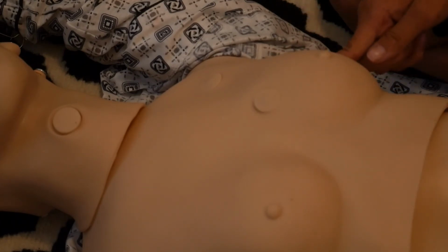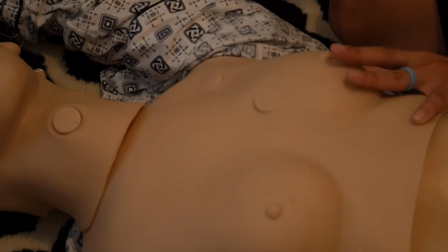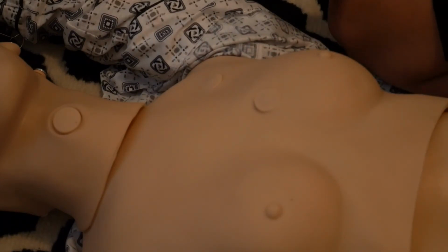Okay, so this is about the right spot right here. Because of the way the mannequin is made, I won't be able to enter in that site. But I enter in the site, go all the way to the hub, wait 5 seconds, monitor the patient. There is improvement. Because there's improvement, I'm going to consider that the needle decompression is successful. In this case, the respiratory distress would improve, the hissing sound, I heard it, oxygen saturation would increase to 90% or greater. There's also a return of consciousness and a radial pulse. And so I would consider it successful.